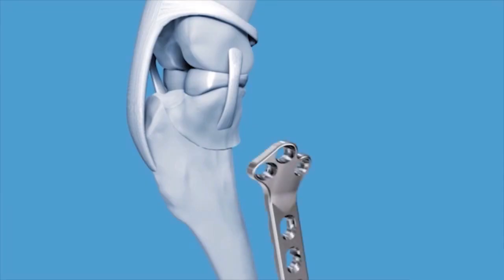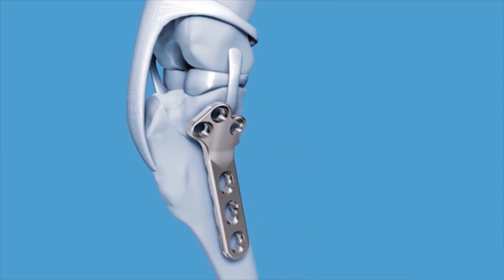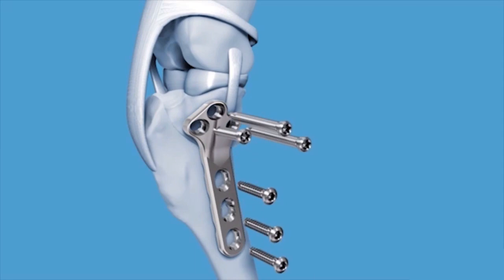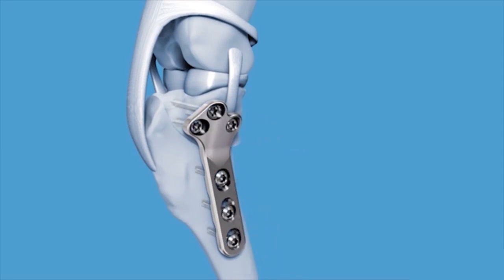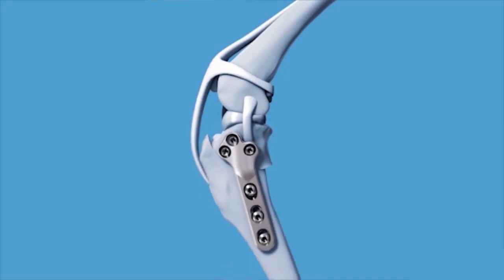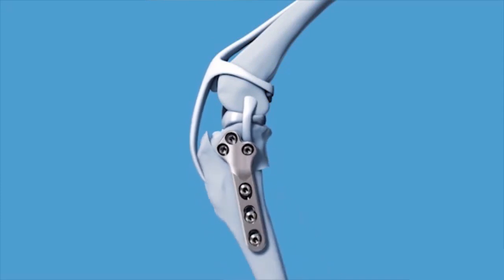The importance of the bone plate is to hold the leveled, corrected bone in this position. The job of the bone plate is to allow the bone to permanently heal in this new position. The plate doesn't work forever, and it doesn't need to. Once the bone is completely healed, it becomes a permanent mechanical change in weight bearing function.